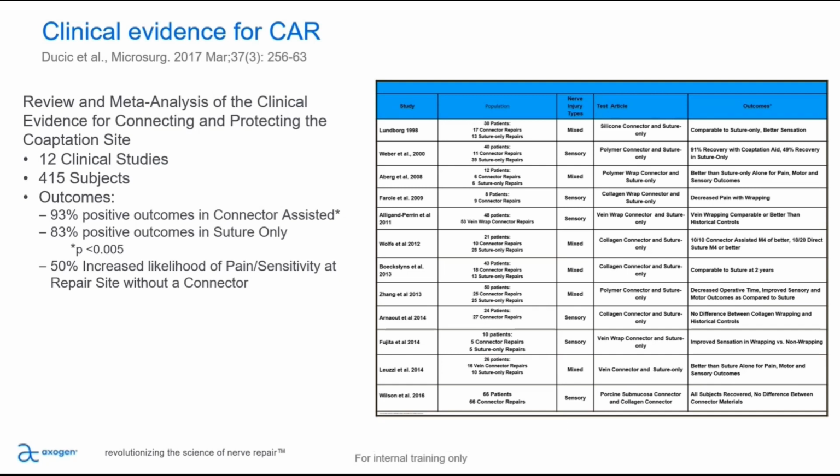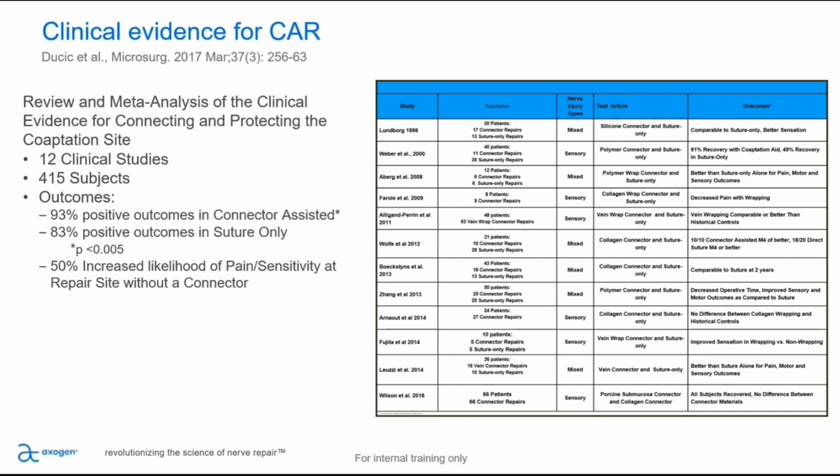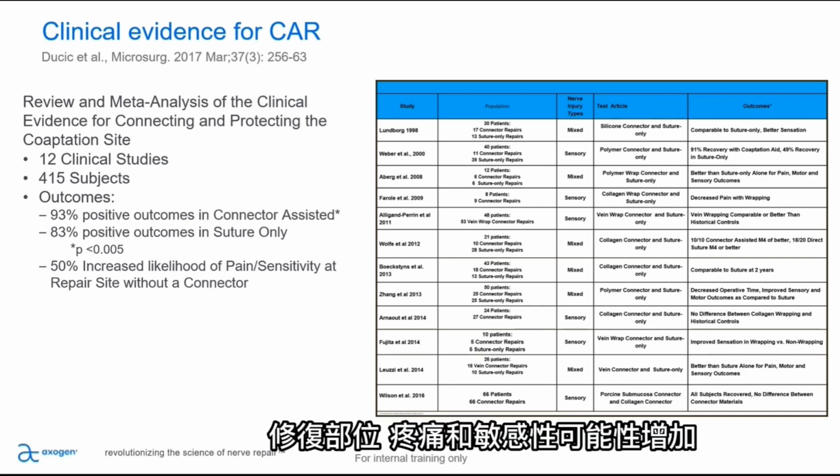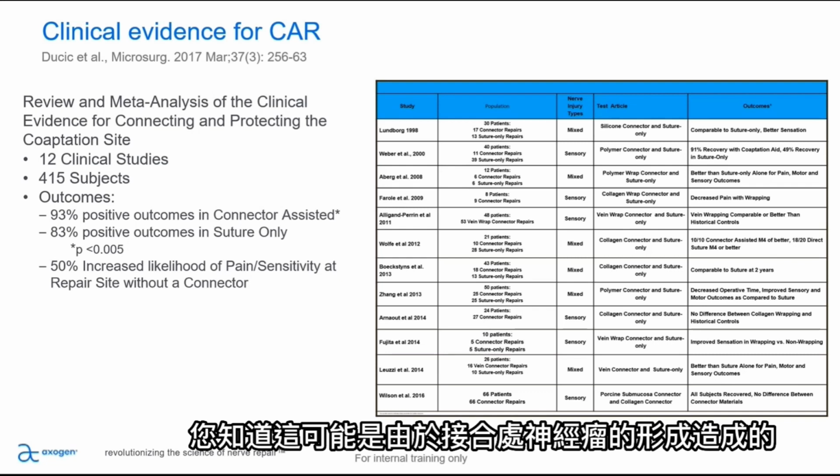And what was really interesting in this study is that there was a 50% increased likelihood of pain and sensitivity at the repair site when a connector wasn't used. And that is probably likely due to neuroma formation at that coaptation.